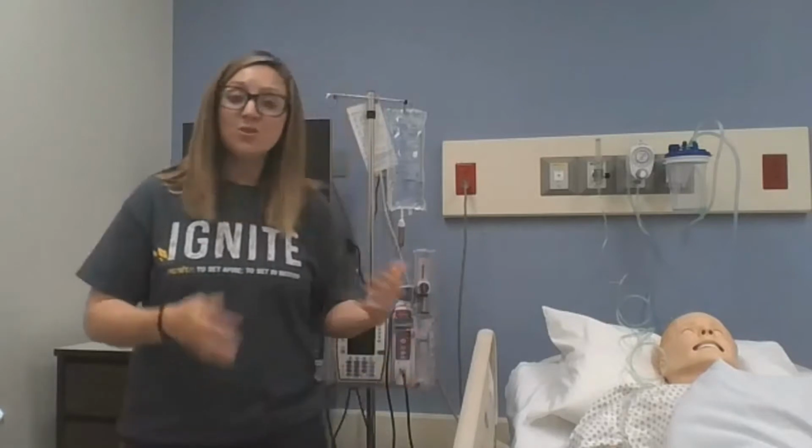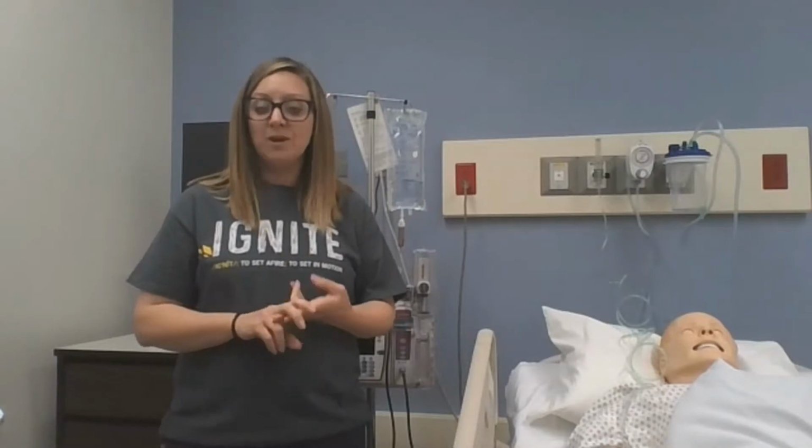Or there's PCA dose only, which means that they just have it attached and they can hit the button and get little boluses throughout the time frame. So those are the different options. It's really important that you have two nurse verification on this for safety measures. You want to make sure that patients that have a PCA pump have all of their safety measures in place. You do want Narcan available in the orders as well in the event that you needed it.